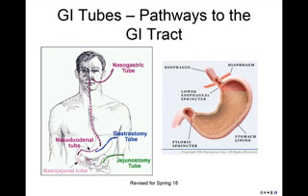It's very important to know where your patient's feeding tube is located. Is the tip of the tube in the stomach or in the small intestines? If the tube is in the small intestines, this position is sometimes referred to as post-pyloric, as it is beyond the pyloric sphincter.